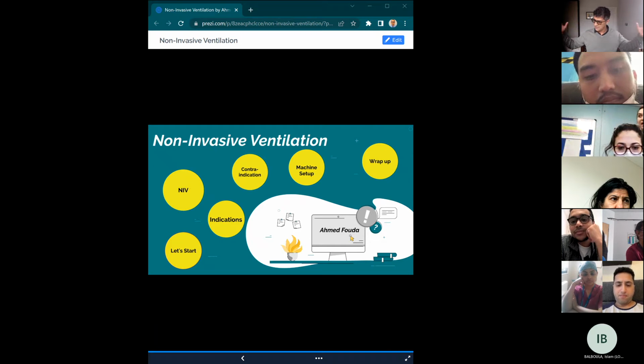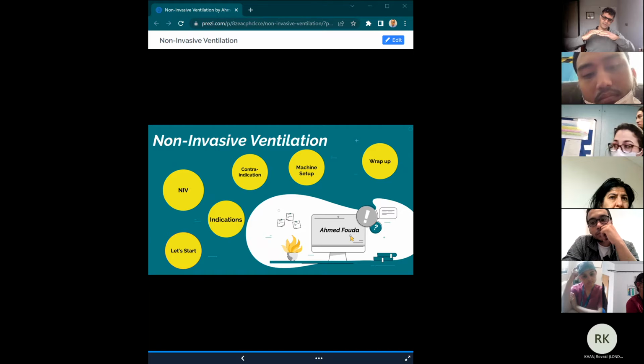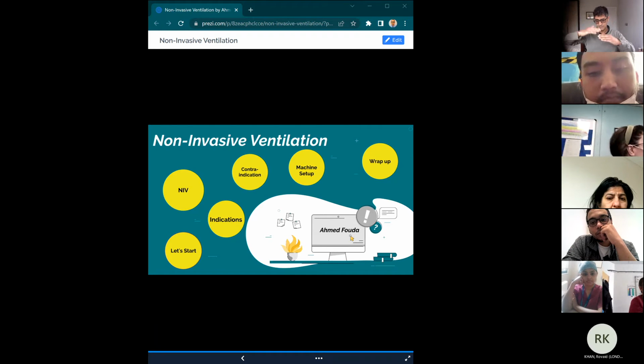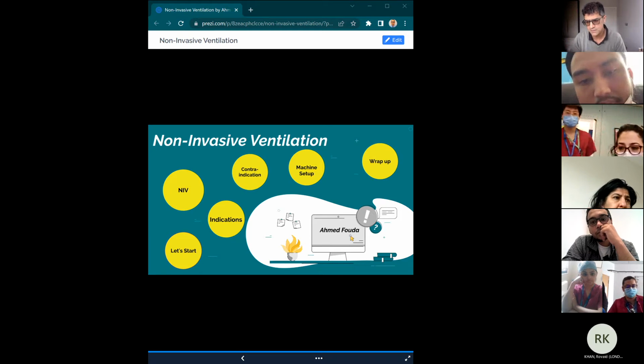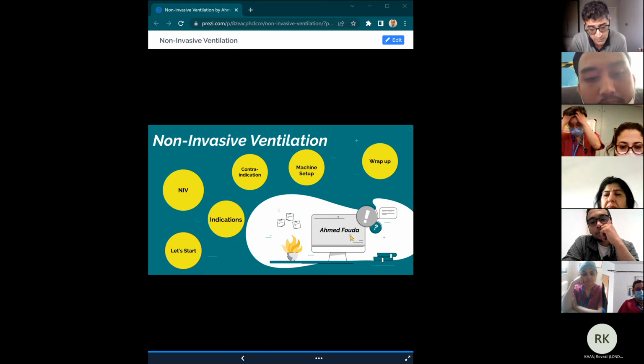And the difference between that PEEP and this PEEP is your tidal volume. If I've got PEEP at 5, and then I increase it to 15, and then drop it again to 5, the difference is that tidal volume. And that's how BiPAP works. But you can generally breathe on top of BiPAP. It's not too bad. You can't when the patient's intubated. It's very difficult.